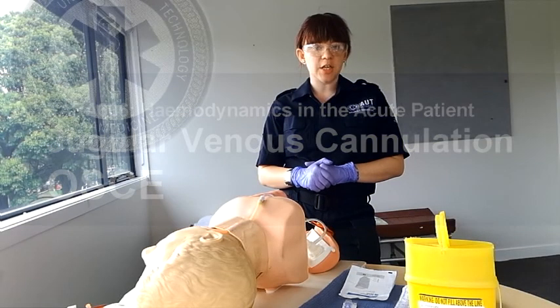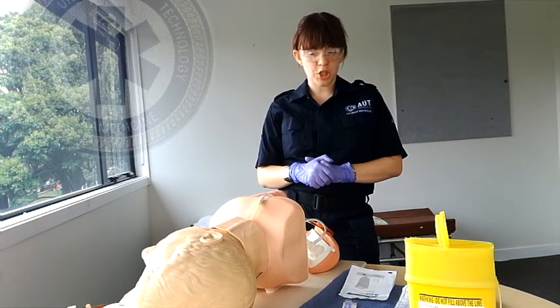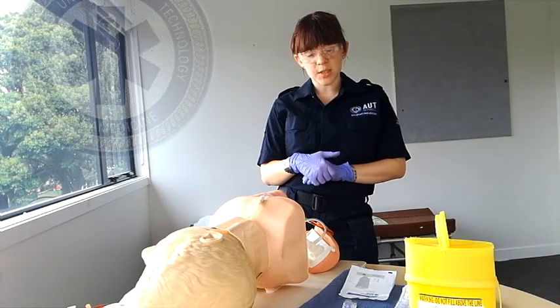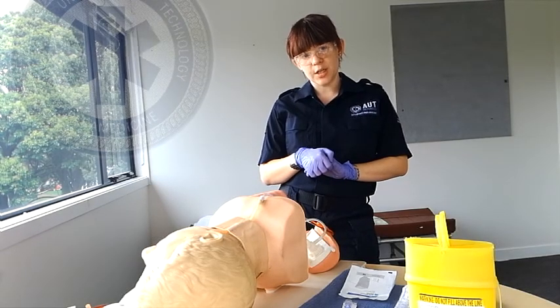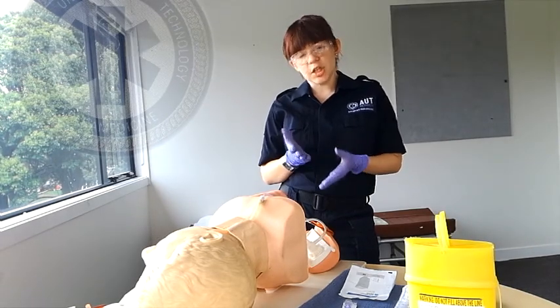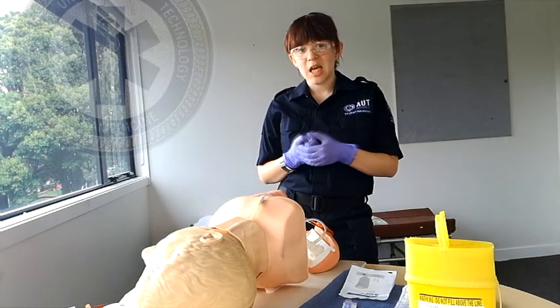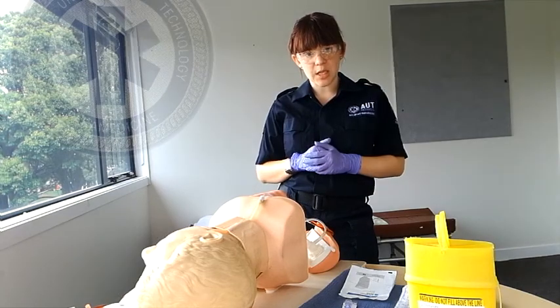This is my EJV OSCE, or External Jugular Venous Cannulation OSCE. My patient here, Steve, has fully consented to the procedure and has already had an injection of lignocaine to the area to help with the process. This procedure can be quite psychologically discomforting to a patient, as well as high risk in terms of complications, so it should be used as a last resort.